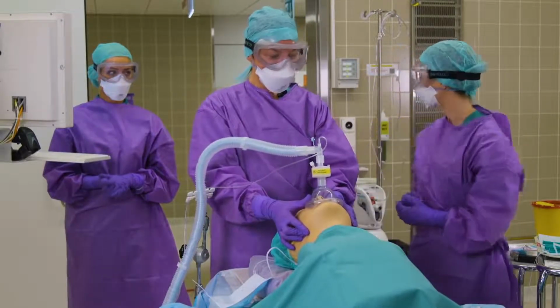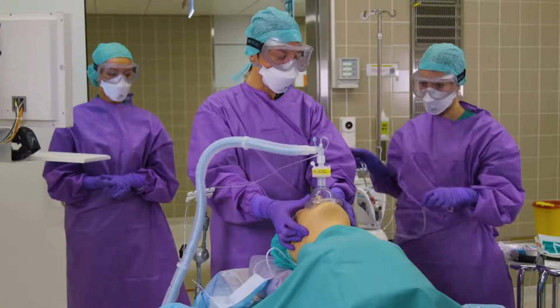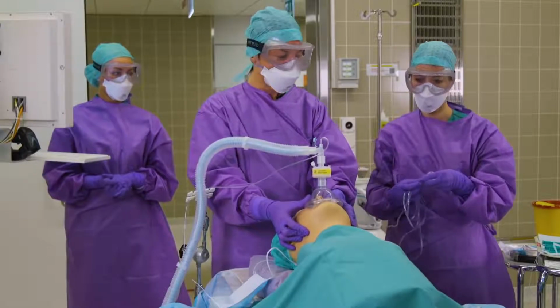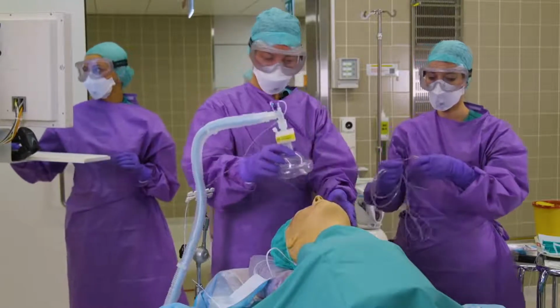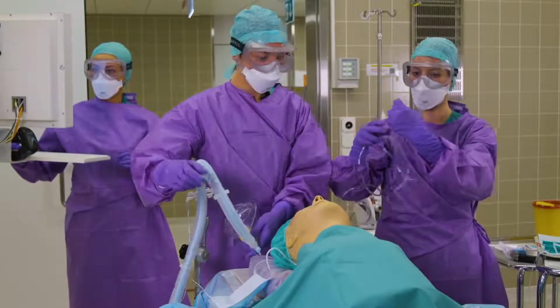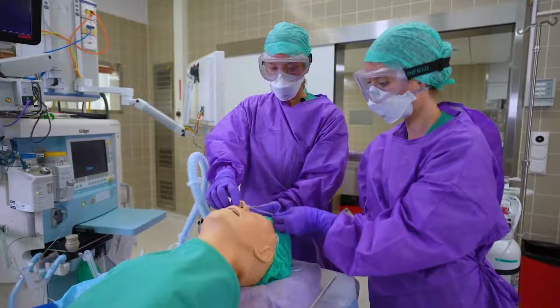Once the patient is adequately breathing, we are utilizing nasal prongs for transport. After the nasal prongs are on the patient will also receive a surgical face mask.